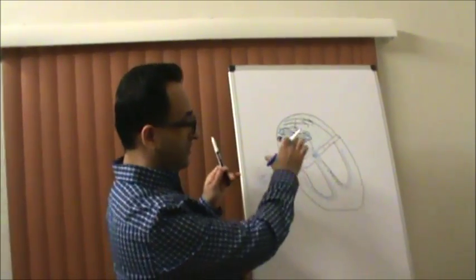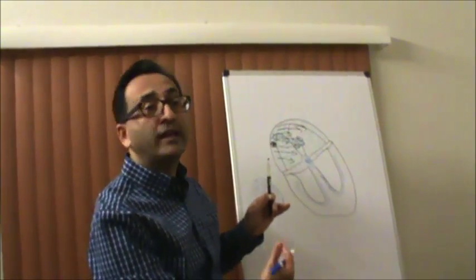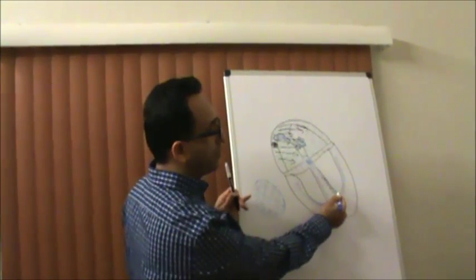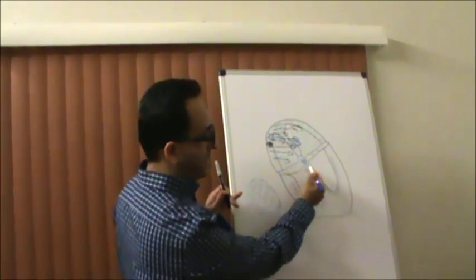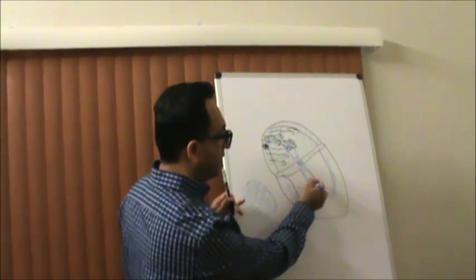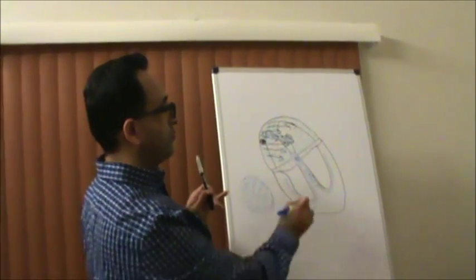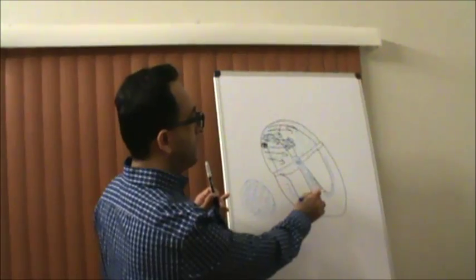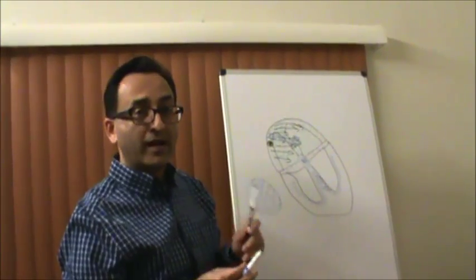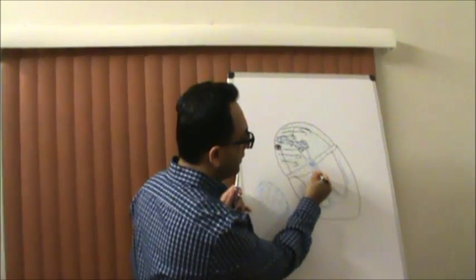Okay? Because we are talking ventricle, so the conduction system or the velocity is quick, faster. And because it goes from bottom to top, it will create vectors like this. So it goes from bottom to top, from left to right. So if we have to draw a cardiac vector, the cardiac vector for that would be like this.